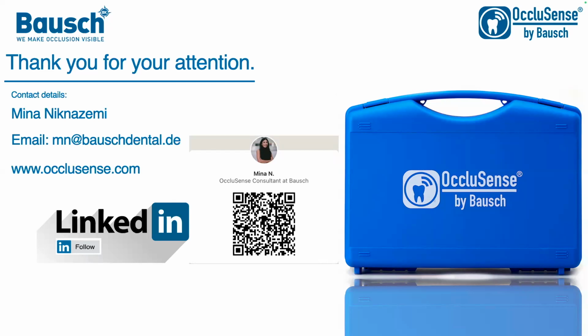And the white area has a part which goes into the holder. So my question was, is that white area, what I see, made up of paper or a plastic material? It's paper. Some parts of the sensor have a little bit of plastic foil, just so it's waterproof because of saliva, but it's mostly paper. Okay.